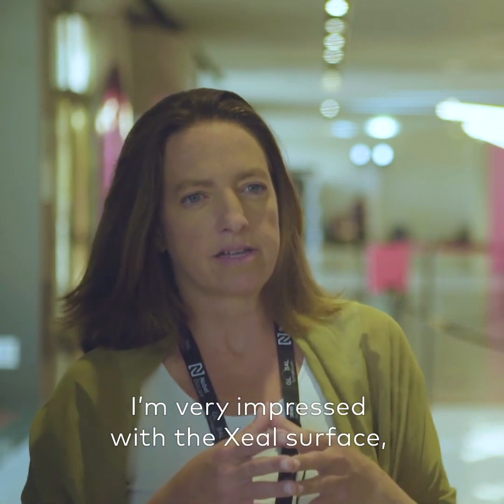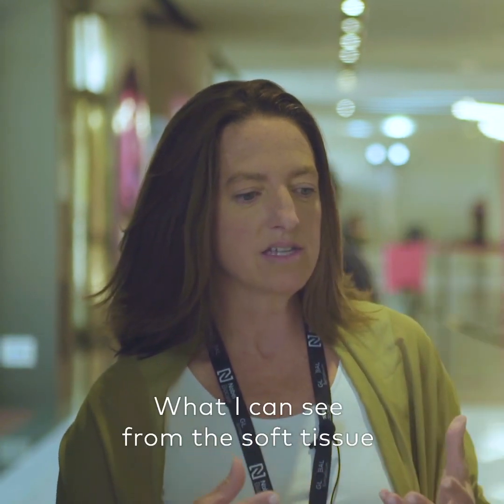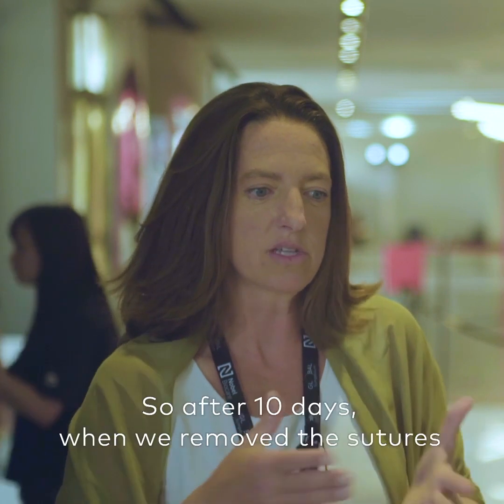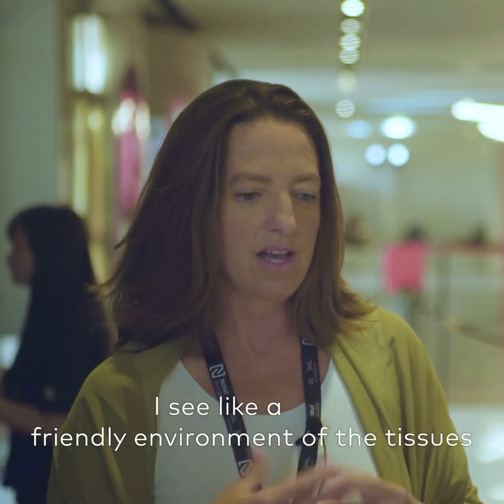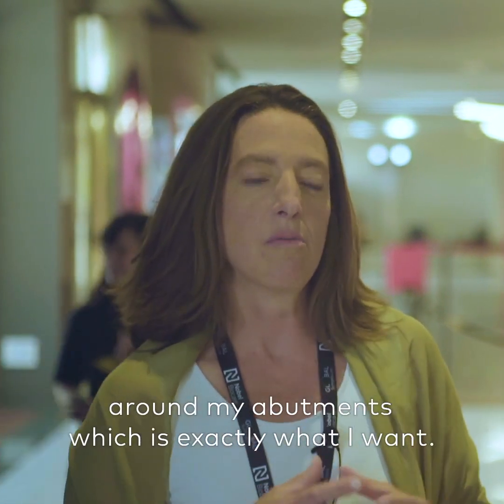I'm very impressed with Xeal surface, although I don't have a long experience because it's something new. What I can see from the soft tissue, from the mucointegration, is unbelievable. After 10 days when we remove the sutures, I see a friendly environment of the tissues around my abutments, which is exactly what I want.